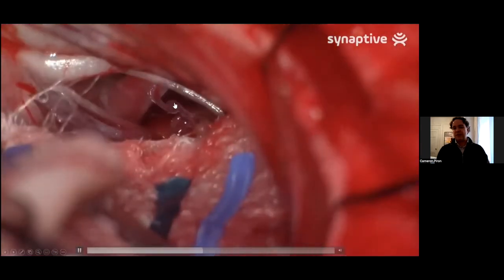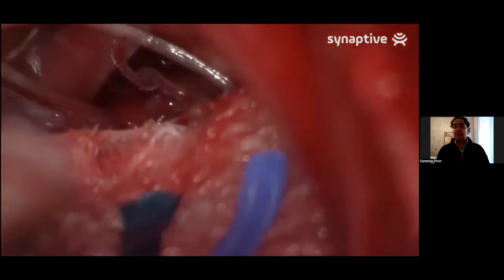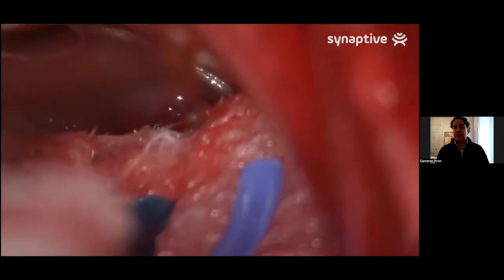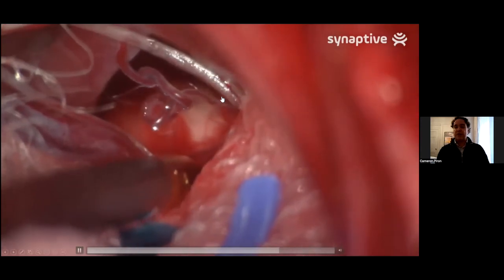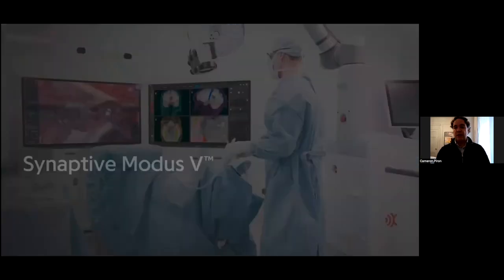And so if you can see these structures, you can avoid them. Or often these structures are the actual targets you want to go in during surgery. You might want to cut out the vessel and make an attachment or replacement. You might want to put an electrode on that nerve. So if you can see these structures, you can either miss them or you can in fact target them.